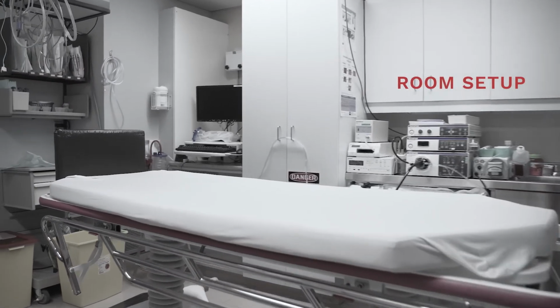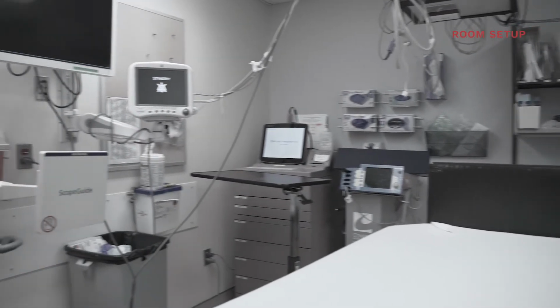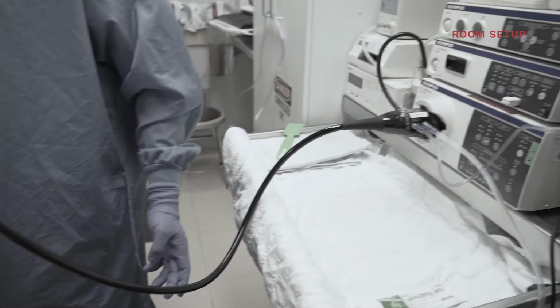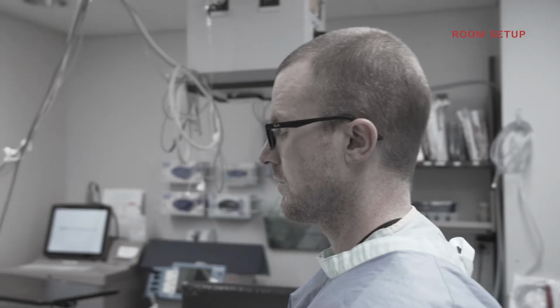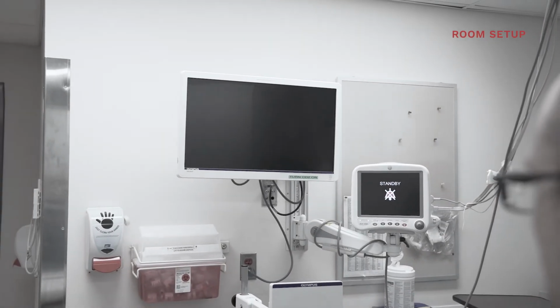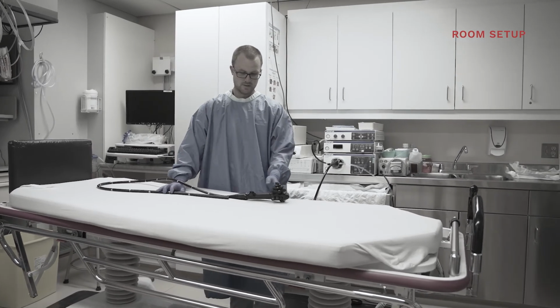Room setup is very important for safe and efficient colonoscopy. Appropriate ergonomics will help prevent injury to the endoscopist in the long term. The ideal setup includes the scope tower positioned behind the endoscopist. This will keep loops and torque out of the umbilicus of the endoscope. The monitor should be across the bed, as shown here, at or slightly below eye level. Because endoscopists come in a range of sizes, monitors should be adjustable. The bed should be positioned so the hips are roughly at the level of the scope umbilicus.